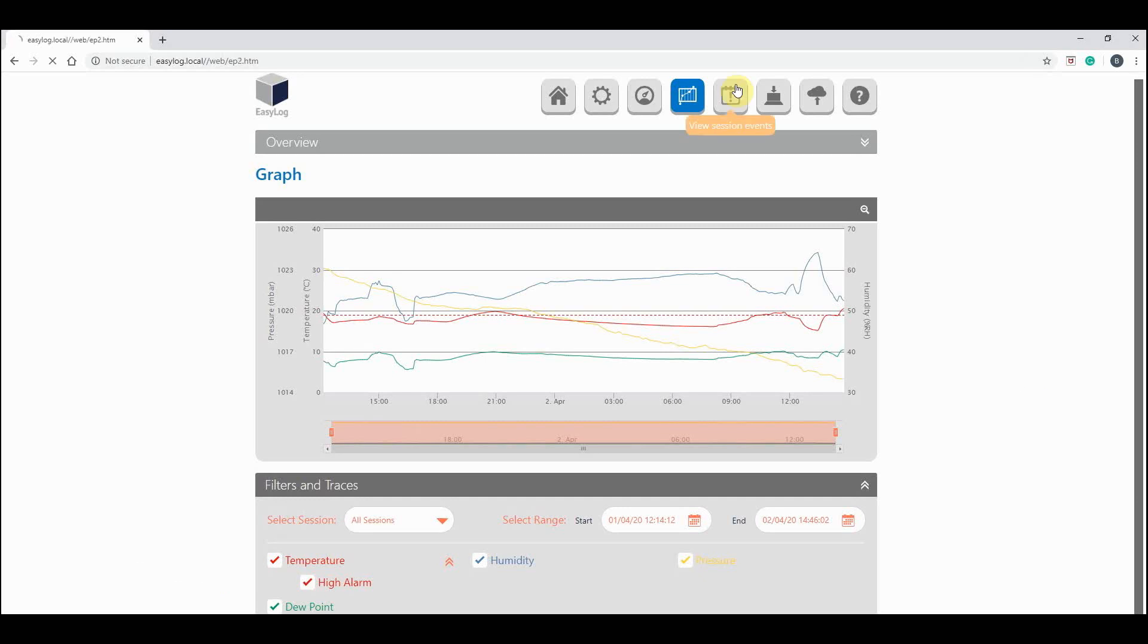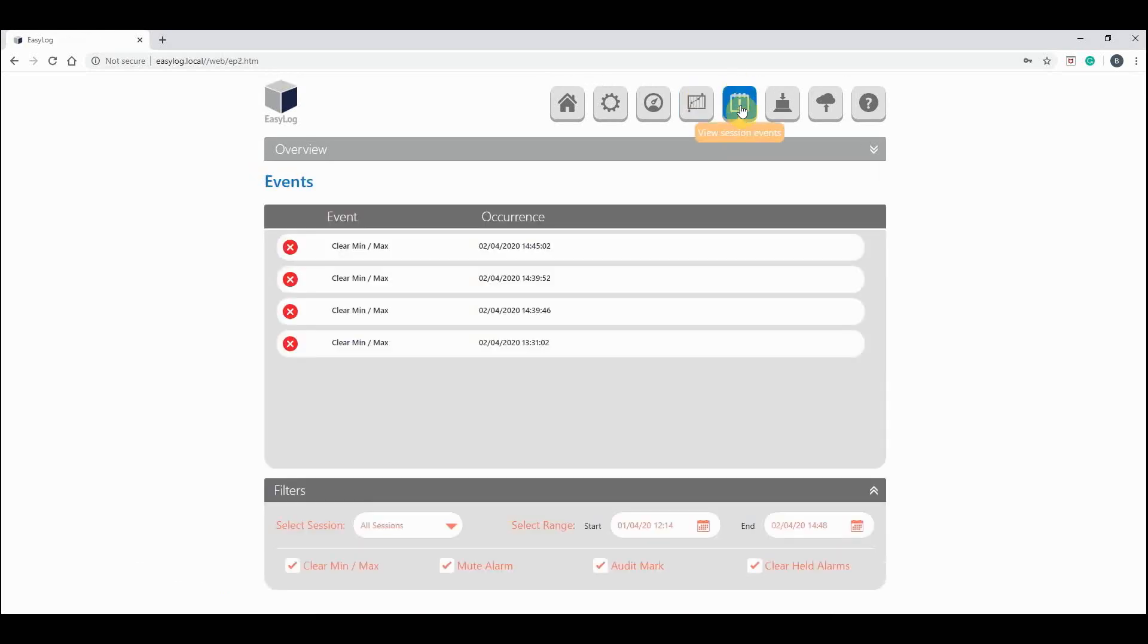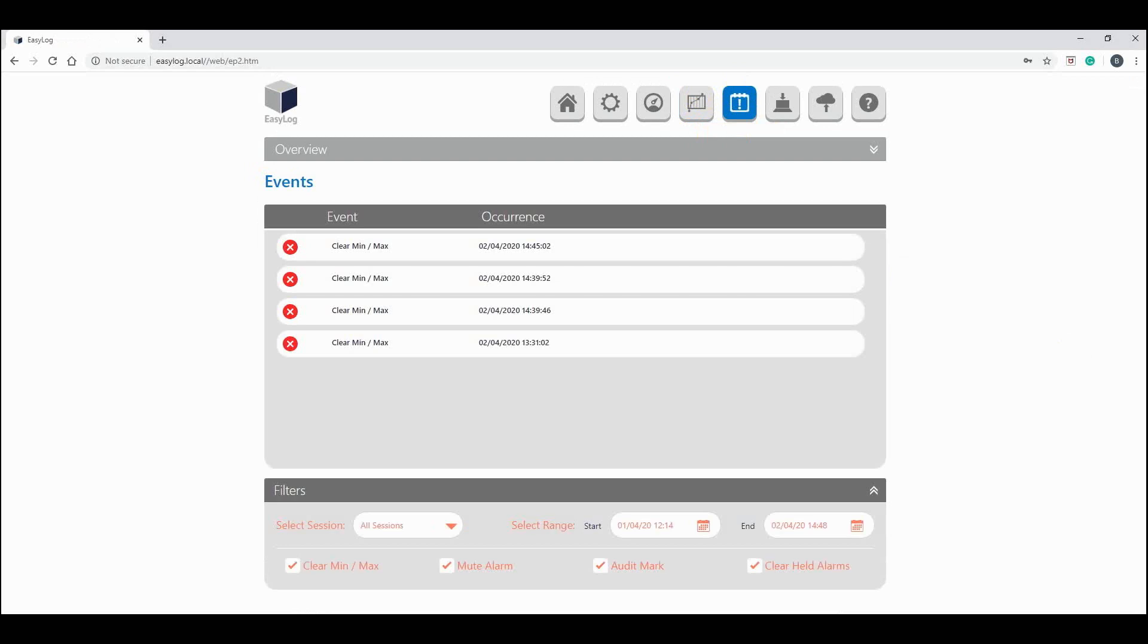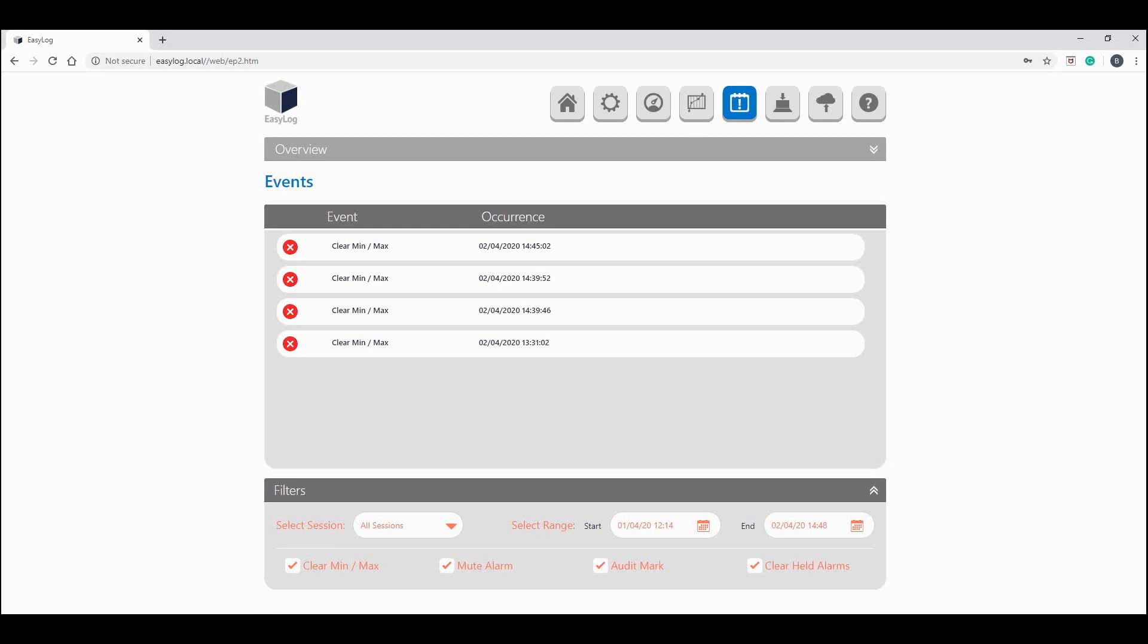If we go back to the top and to the next icon along, we get view sessions events. And this identifies various events that have occurred on your device. You might remember that I told the logger to clear the min-max readings earlier in this tutorial. And this action is identified here. We also get a handy date and time to tell us exactly when this was done.